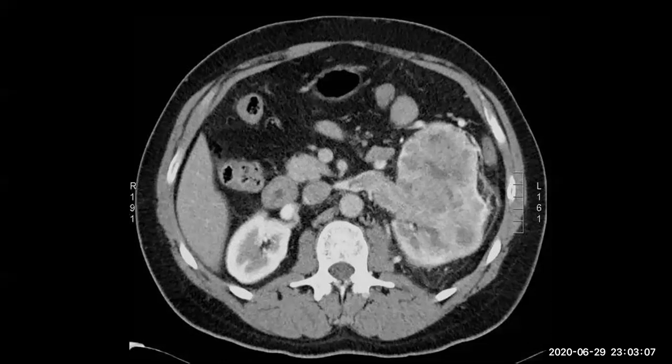Abnormal left kidney, sure. Abnormal shaped kidney. Is it reniform or bean shaped? Reniform shape, or bean shape. Can you appreciate any normal kidney tissue in this patient on the left side? No, but thin, on the left side. No, I can't.